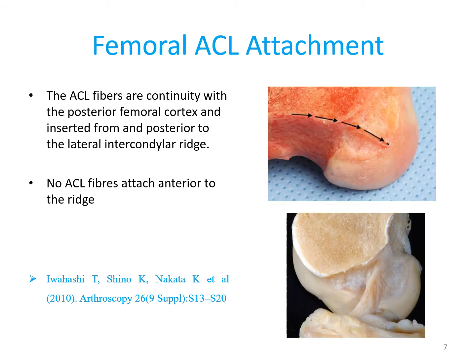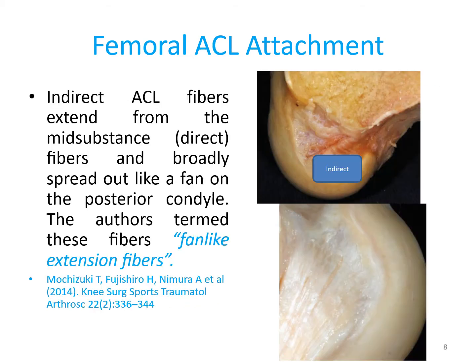Coming to the femoral ACL attachment, it's important to note that no ACL fibers attach anterior to the ridge. So please note the lateral intercondylar ridge and move posterior to it. Your whole graft should be between the lateral intercondylar ridge and the over-the-top position or the posterior articular margin, and it should be horizontally oriented. Expanding from these main direct fibers come the indirect ACL fibers like a fan shaped to reach all the way to the posterior articular margin of the posterior condyle.